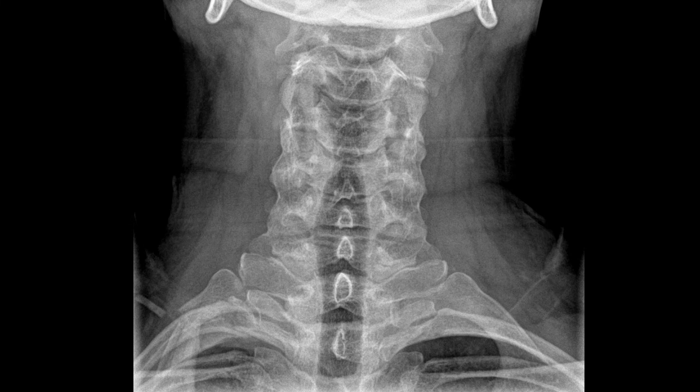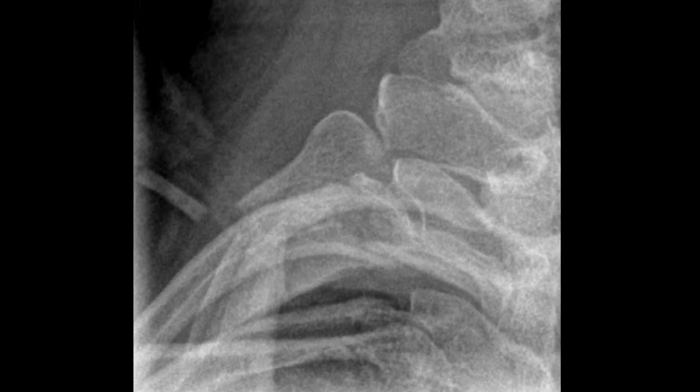This is a 21-year-old male who was a passenger in a high-speed motor vehicle accident. There is an acute fracture of the first rib, which is a common injury to see on cervical spine images following a motor vehicle accident. Always keep an eye out for this area — because of the patient's seat belt, fractures can occur in this region.